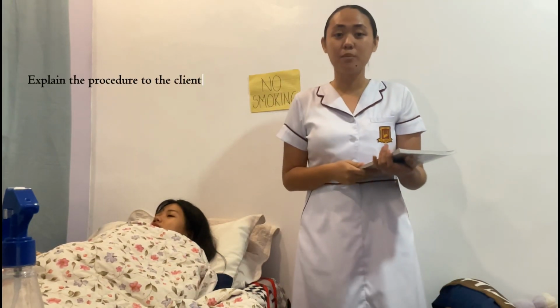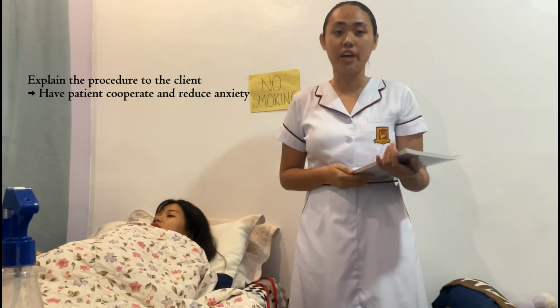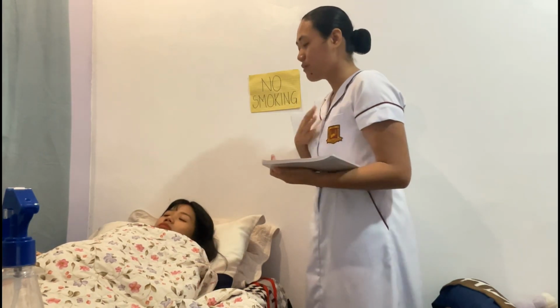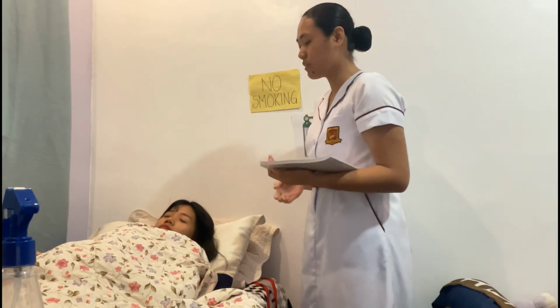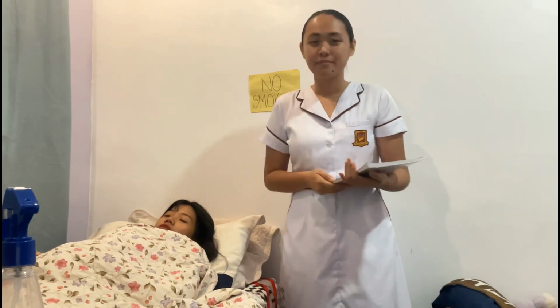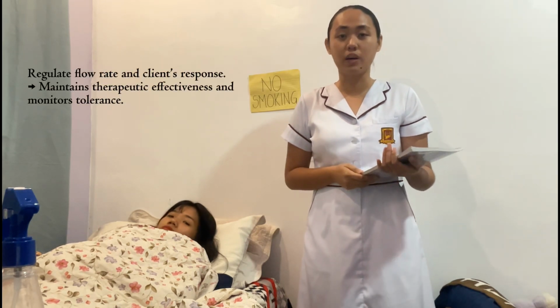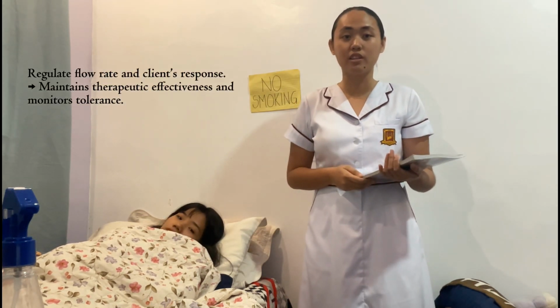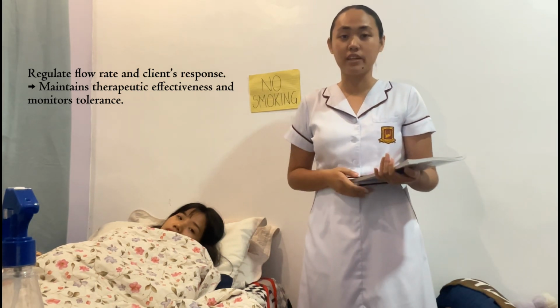And then explain the procedure to the client. So this is to promote cooperation and reduce anxiety. So good day, ma'am. My name is Lagrama. I will be your nurse for today. So ang atong buhaton karon is mag-administer tag oxygen sa imo, ma'am, ha. And then we are going to regulate the flow and monitor the client's response. This is to maintain the therapeutic effectiveness and monitor the tolerance.